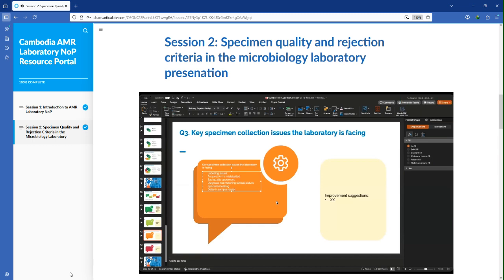And also one more thing, related to the culture non-growth. When we see the bone specimen, we expect that the patient has taken antibiotics. Yeah, that's a good one. I think sometimes that is inevitable, but this is something good to note.